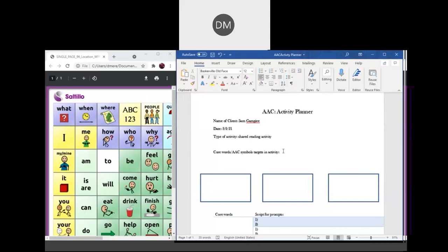However, especially with dynamic AAC systems, there are other folders, other categories in which the client can interact in the activity. Like I believe on the WordPower 60 Basic, there's usually a categories button which can open up to different jobs.